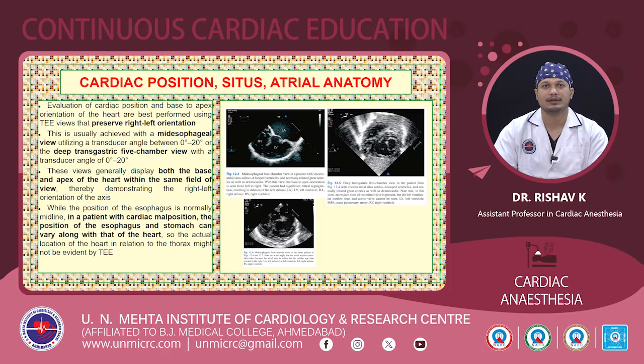The mid-esophageal 4-chamber view is a very useful view because it can provide a large amount of information in one go. We can determine the orientation of the cardiac apex as well as the position of the heart, and that can be best viewed using the mid-esophageal 4-chamber view. Another view that we can use in this case is the deep transgastric 5-chamber view, because as I've already told, these views display both the base and the apex of the heart in the same field of view. While the position of the esophagus is normally midline, the position of the esophagus and stomach can vary along with the heart. So the actual location of the heart in relation to the thorax may or may not be evident by TEE.